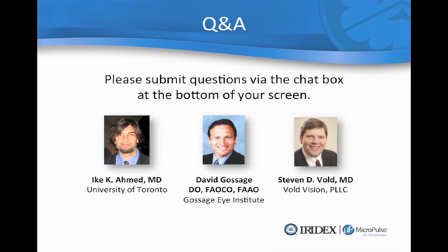This is Steven Vold here, and I'll just take my shot at this. Can you hear me okay, Ike? Thanks, Steve. Okay, great. Well, here's kind of what I do. I will tell you, many patients struggle with starting medications or don't want to use them. Cost, forgetfulness, or just a reduced quality of life with starting a medicine. Then I feel very comfortable using this as a first-line therapy.